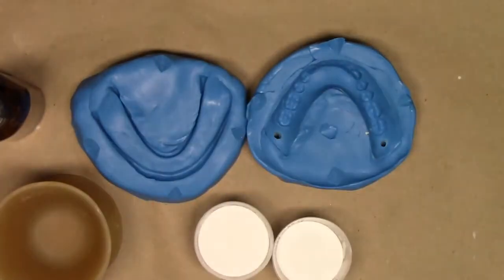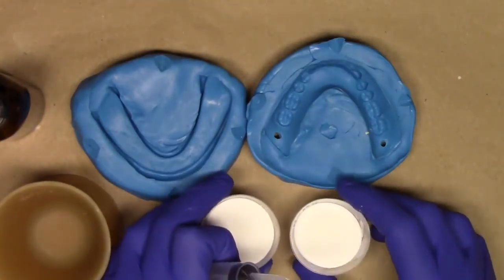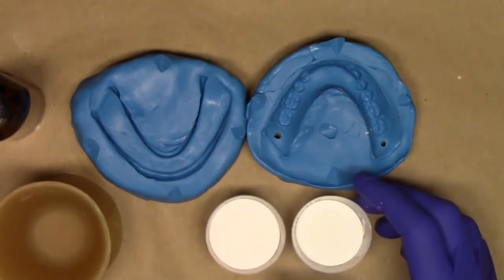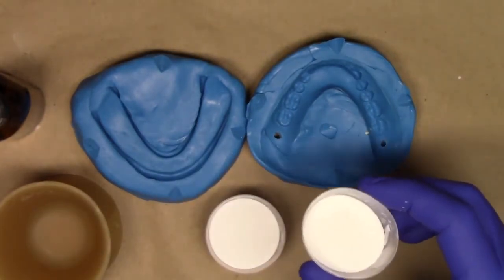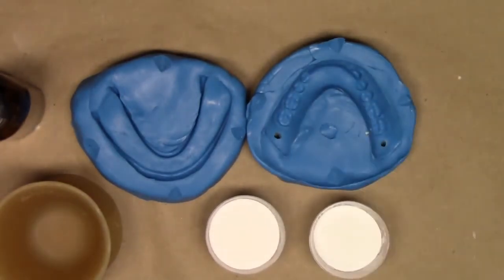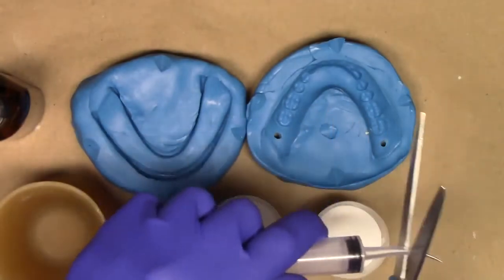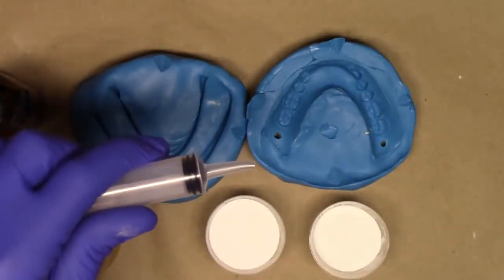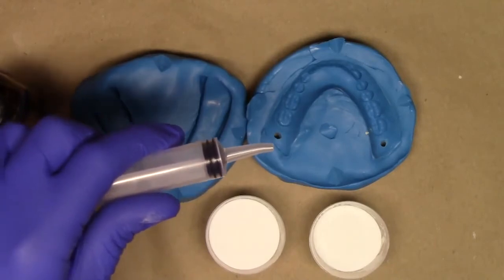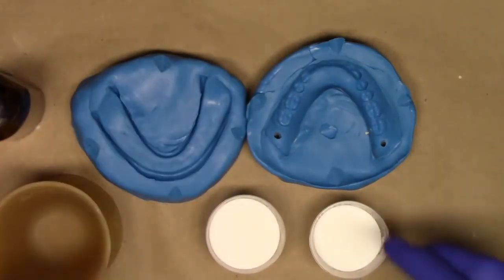Now I have an extremely large denture because this is the one that we used in our course, so I have to use a little bit extra of the clear resin powder. However, in most clinical situations, 25 to 30 milliliters of the powder is more than sufficient. First step is I take my monoject syringe and I just trim off about 7 millimeters off the tip of the monoject syringe, so that way it injects a little bit easier.